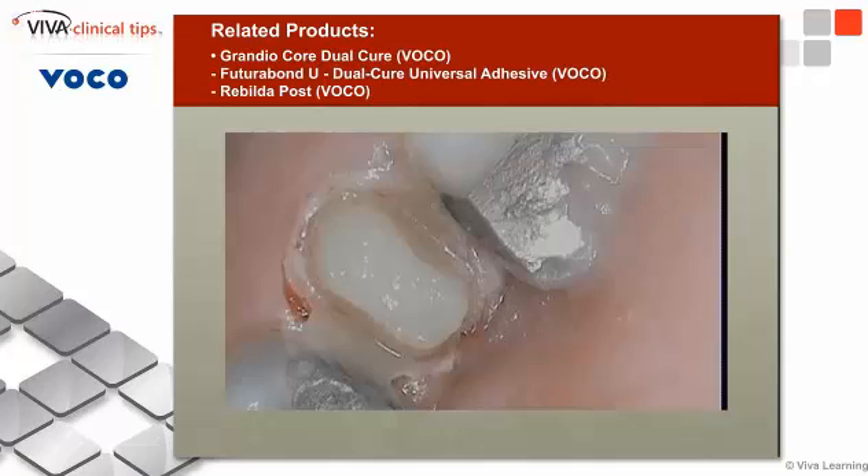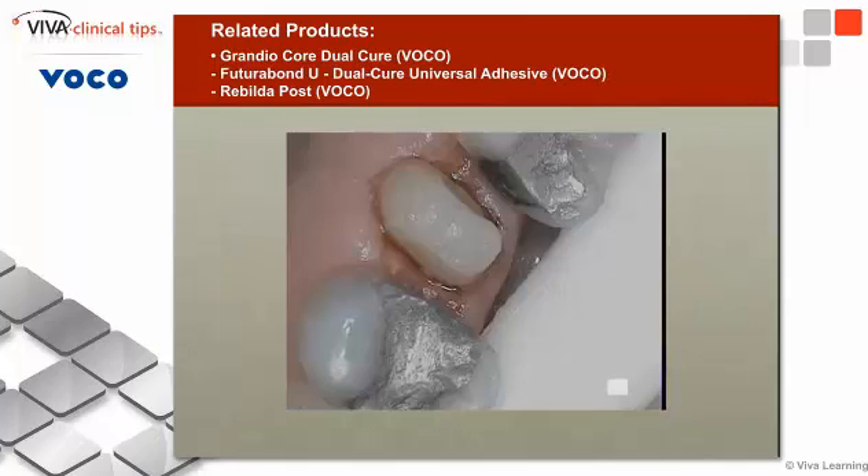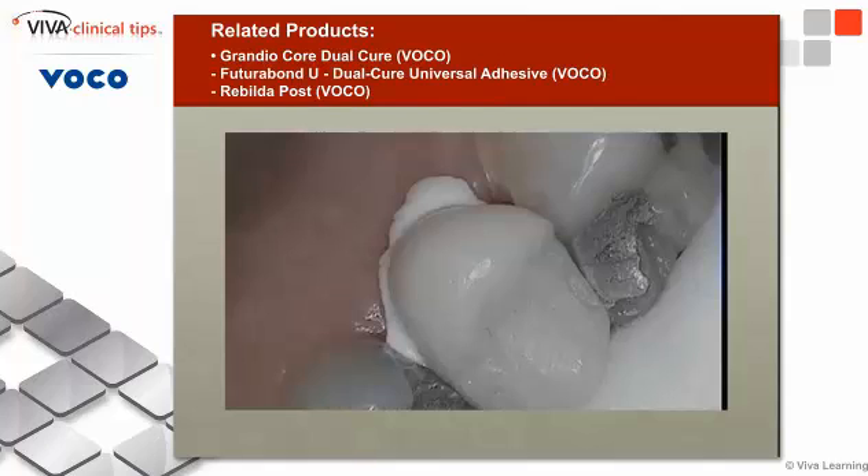Then I gently bring the crown off the tooth — that was the whole purpose of placing the Vaseline inside. I then go ahead and prep the tooth back, being very careful to avoid the margins. I do not want to alter the margins of this tooth; I just want to remove the flash, which I might do with finishing burs like an ET9, or with an explorer or a scalpel, depending on what I think is needed.